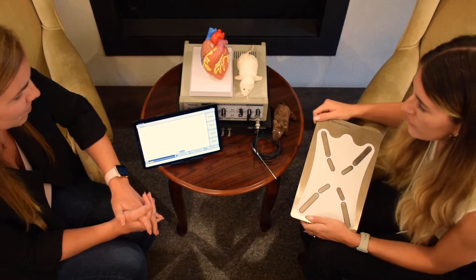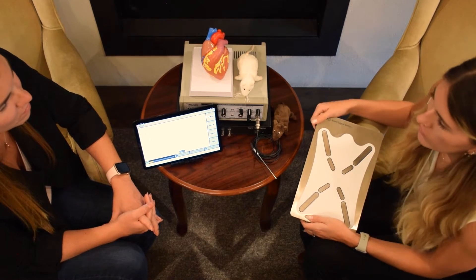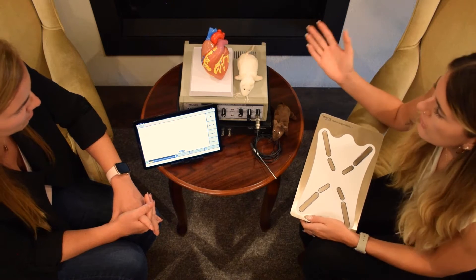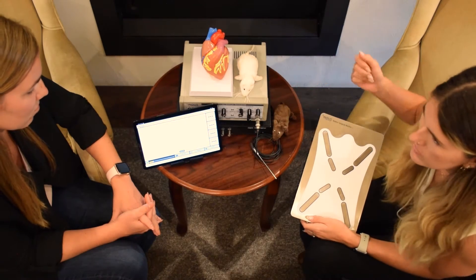We can integrate ECG in real time with the collection of our Doppler signals. This is important to tell us whether the signal is happening in systole or diastole, and where on the QRS complex it is occurring.